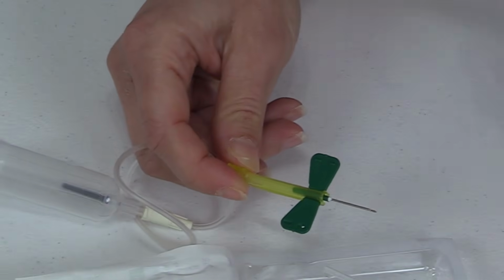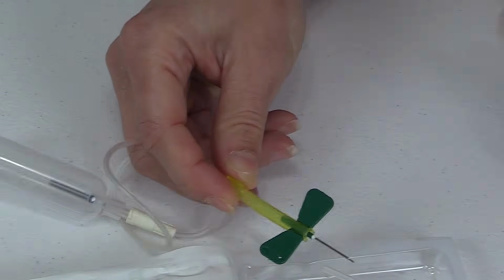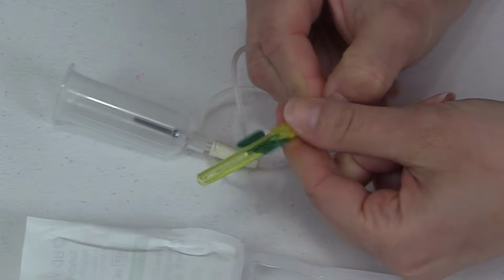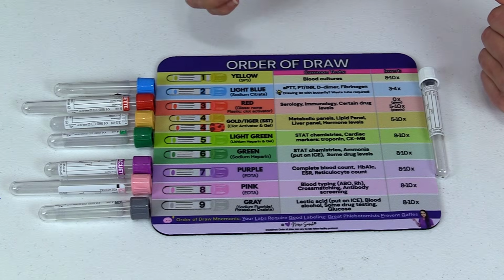Some of these have buttons that you would hit and it would retract the needle. This is a little bit different. When you're done using it, you're actually just going to slide it off like this, and then you can discard it into the sharps when you're done with it. You also want to get the tubes that have been ordered on your patient.